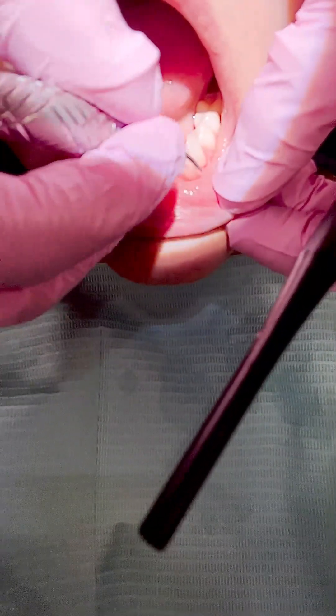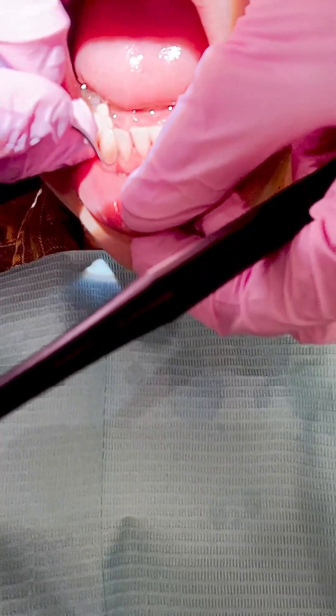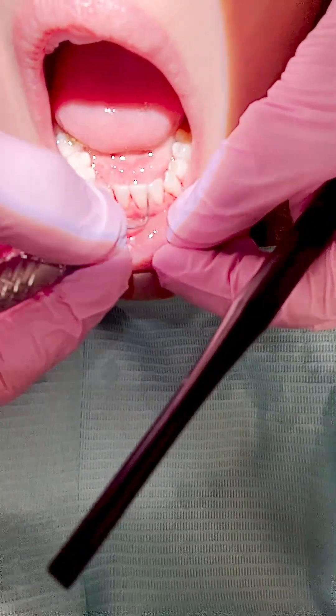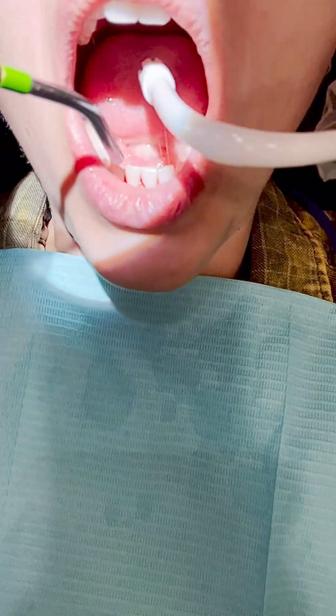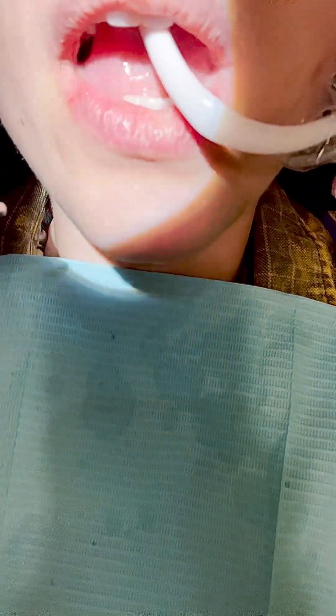There's a sheet of calculus that builds up on everyone's teeth in these areas. When we cavitron, we mostly cavitron the gum line area. I'm still sitting from 12 o'clock getting the straight of the tooth, then coming in interproximal — left and right, bouncing. I drop my hand down and go flat with the sickle — that's how you get up into those contacts. This helps avoid getting the instrument stuck and gets that little interproximal aspect a lot better. Calculus hides right underneath the contact supragingivally in these areas.